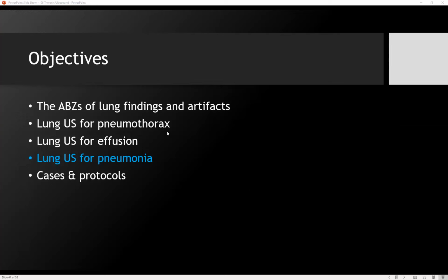And as far as I know, the diaphragm isn't going to get stronger by keeping patients intubated longer. So there is prognostic information that you can tell about patients' likelihood for reintubation potentially from using diaphragmatic ultrasound. And potentially it'll inform whether or not you want to extubate to BiPAP or CPAP. But I don't know that the data is all there yet for this to become a regular practice. So that's excluded from this discussion, but that's a shout out to the fact that it exists.